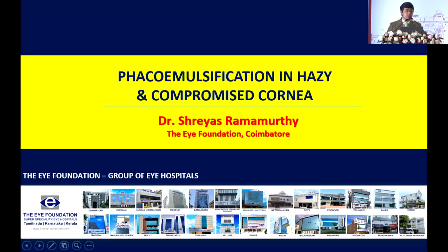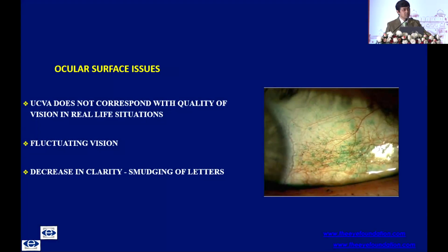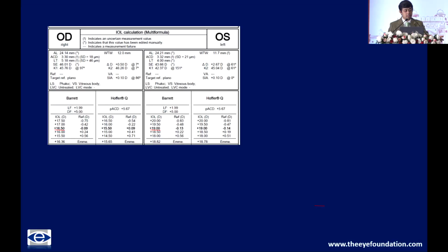Thank you, sir. So I'll be discussing phaco in compromised corneas and hazy corneas as well, and take you all quickly through some common situations initially. The most common of these being dry eye. Frankly, while dry eye doesn't hamper our cataract surgery per se, it is really the preoperative measurements that it is going to drastically affect.